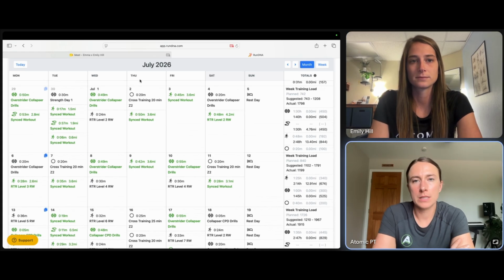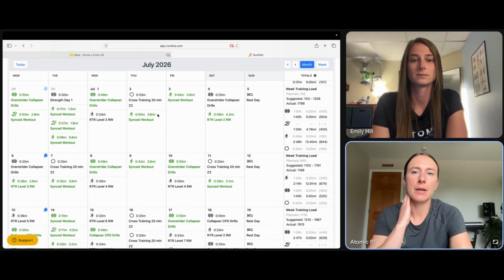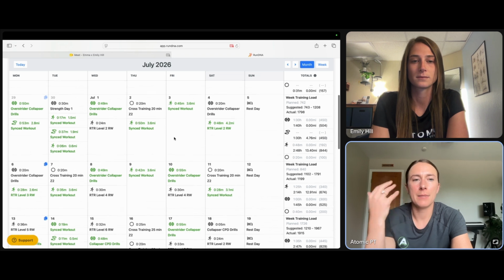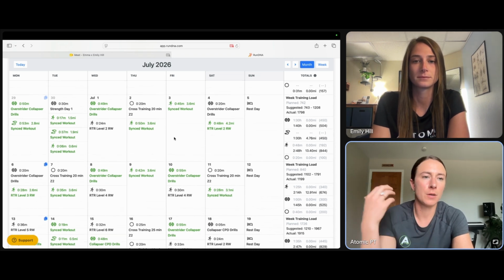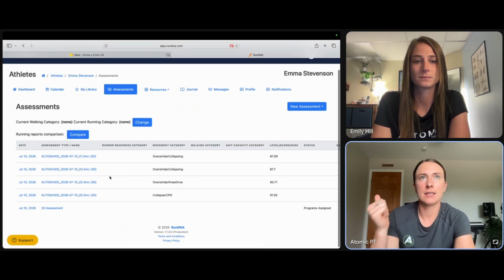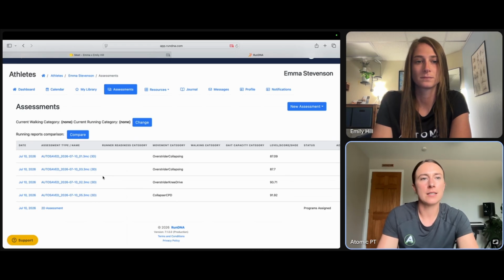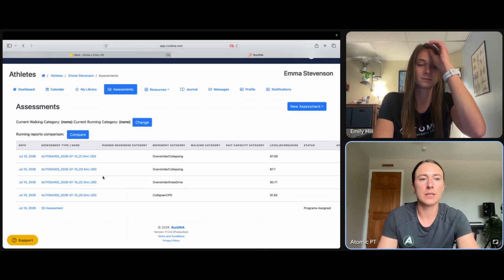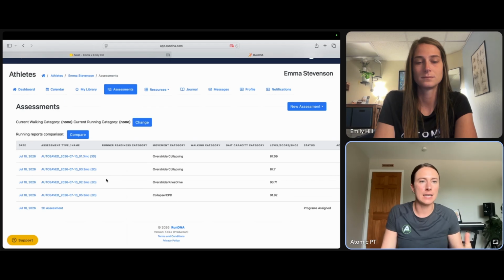And then when we were together, what was also cool, and we don't need to go into the separate stuff, but just as a comment, you were able to take my results from my first run and then give me a few cues to work on to see if it would improve or not improve. And I think what we learned from those experiences is, if you can make improvements on the spot, it's something that is a little bit easier to fix in terms of just making those neuromuscular changes. But if scores are lowering, or if I'm not able to do it, it's more of a mobility strength issue that's going to take more time.